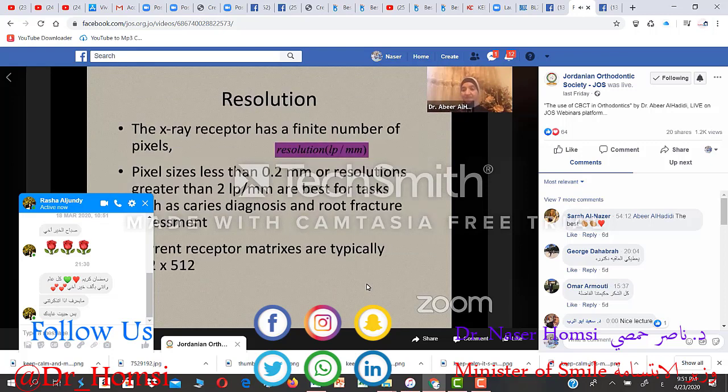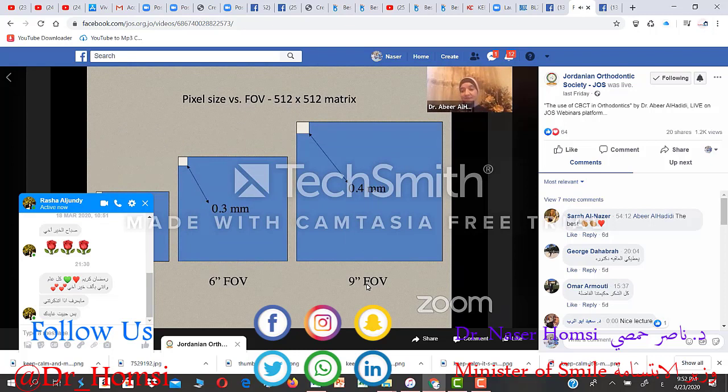However, one of the major advantages, meaning the strengths of cone beam CT, is its spatial resolution. Spatial resolution is a feature of the imaging technology that would allow me to tell small structures apart even when they're close together. It's like it tells me how many details I can see in the image. And with cone beam CT I can actually see more details. Probably most of us in dental specialties would need the spatial resolution rather than the contrast resolution, because I want to know details of the cortices, details of the relationship between the tooth and the periodontal ligament space. If I'm talking about structural changes that I see, for example, around a root of a tooth right next to an impacted tooth, or structural changes in the condylar head, for example. Those are all radiographic tasks that would need spatial resolution, which is great because the CBCT has the spatial resolution that we need for these tasks.